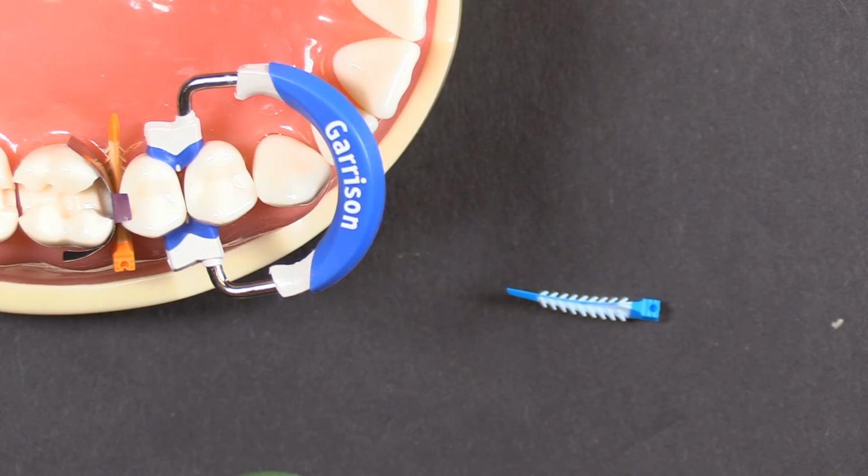You might take a look at what you're using as your etching and bonding process, and maybe consider jumping up to a 7th generation product. They're a little more forgiving. They're not as technique sensitive. Something like 3M's Scotch Bond might be something that you'd want to investigate, and maybe check out a little bit of literature out there on the 7th generation bonding agents and see if that might be a way for you to correct that issue.